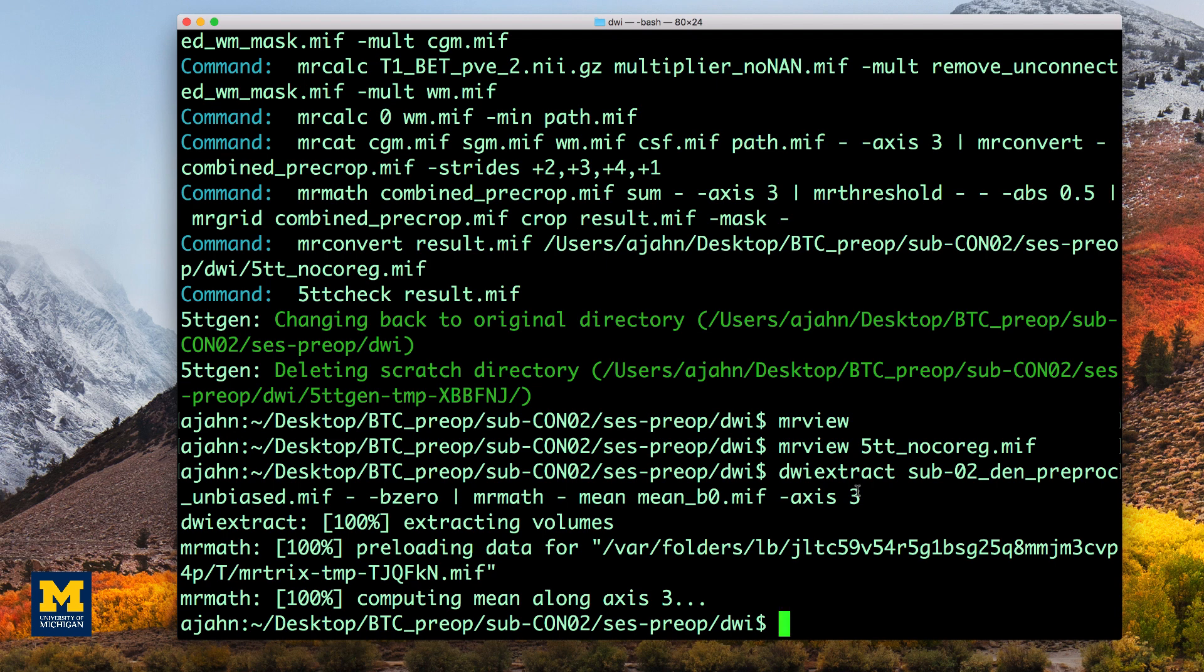In order to carry out the co-registration between the diffusion and anatomical images, we will need to take a brief detour outside of MRTRIX. Although you can choose any software package you want, we will focus here on FSL and its FLIRT command.